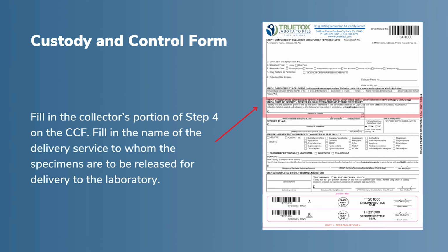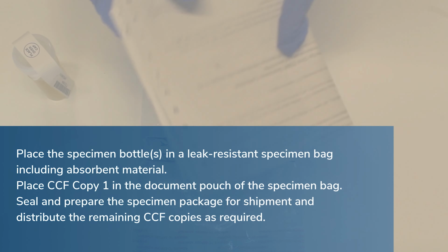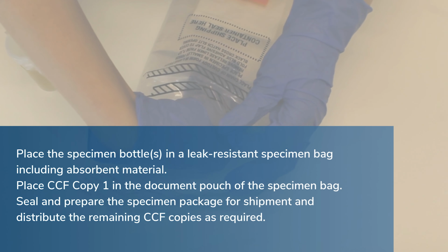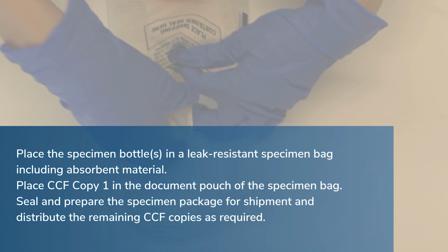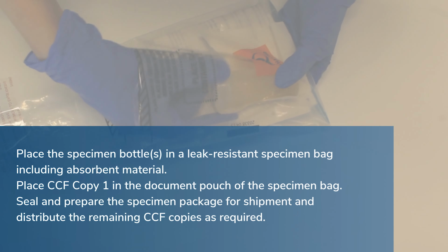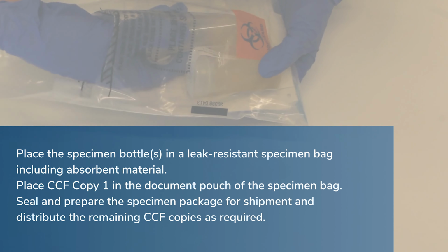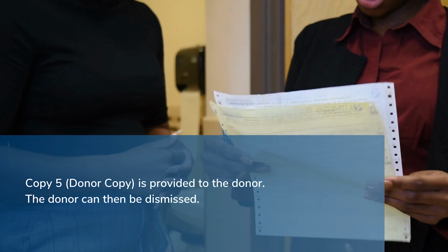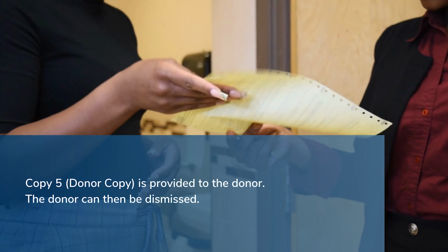Fill in the collector's portion of Step 4 on the CCF. Fill in the name of the delivery service to whom the specimens are to be released for delivery to the laboratory. Place the specimen bottles in a leak-resistant specimen bag, including absorbent material. Place CCF Copy 1 in the document pouch of the specimen bag. Seal and prepare the specimen package for shipment and distribute the remaining CCF copies as required. Copy 5, the donor copy, is then provided to the donor, and the donor can be dismissed.